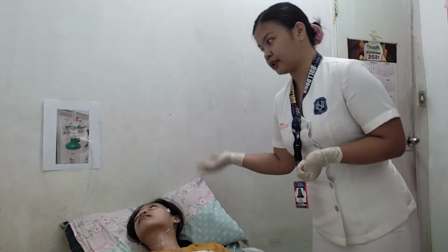Ma'am, I will just ask you something. Do you have dryness or irritation after administering the oxygen by nasal cannula? Okay, great. Because dry mucous membranes are more prone to break down because of friction or pressure from the nasal cannula. Okay, ma'am, we need to regularly check the water level of the humidifier to see if it is still the right amount of water. I will check it later. This ensures continuous humidification and prevents dryness of the mucous membranes.